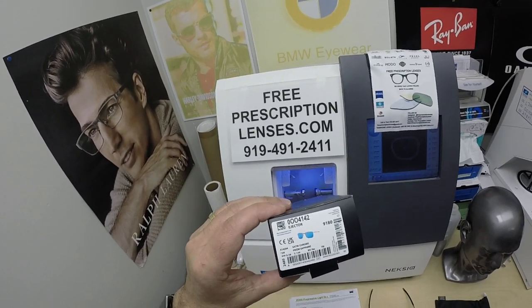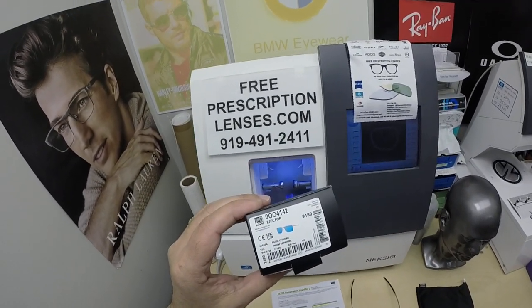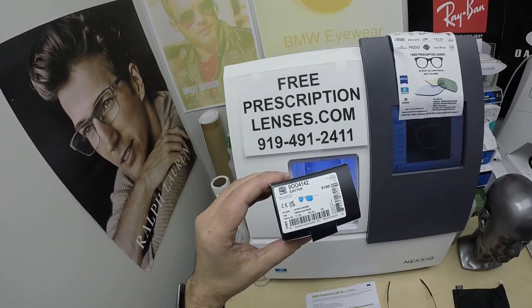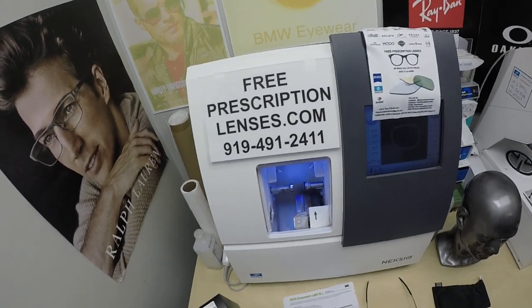Today I'm showing you Mark's Oakley 4142 — this is the Ejector. It sells for $184, complete with one free pair of clear single vision prescription lenses.